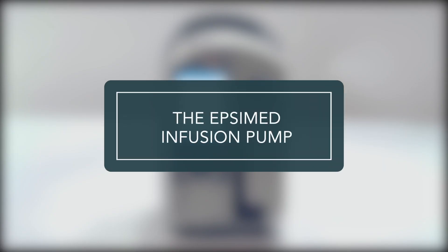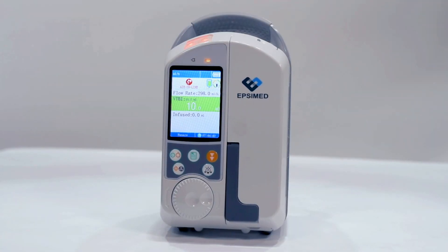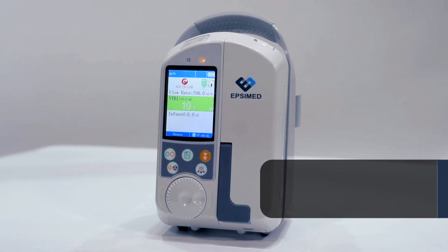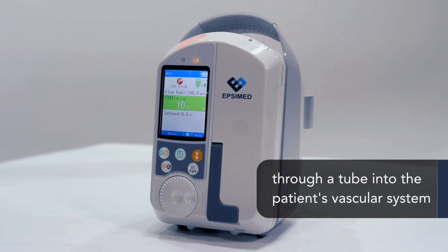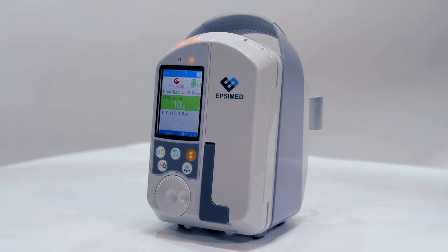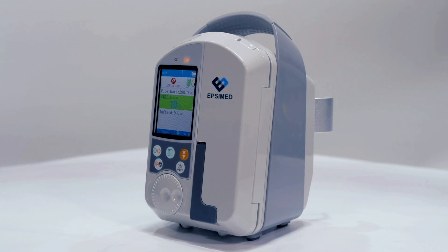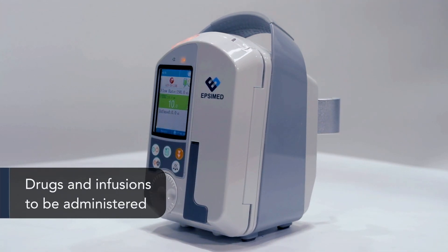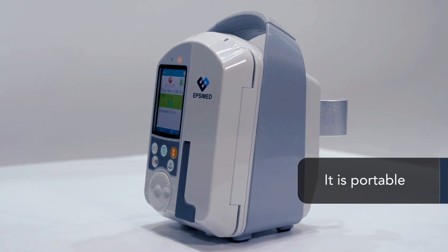The EPSI med infusion pump is a curvilinear peristaltic pumping mechanism that generates mechanical pressure to move fluid through a tube into a patient's vascular system, achieving a more precise delivery of fluids. It allows all kinds of parenteral and enteral solutions, drugs, and infusions to be administered. It's adaptable to patient needs and is portable thanks to its rechargeable battery.